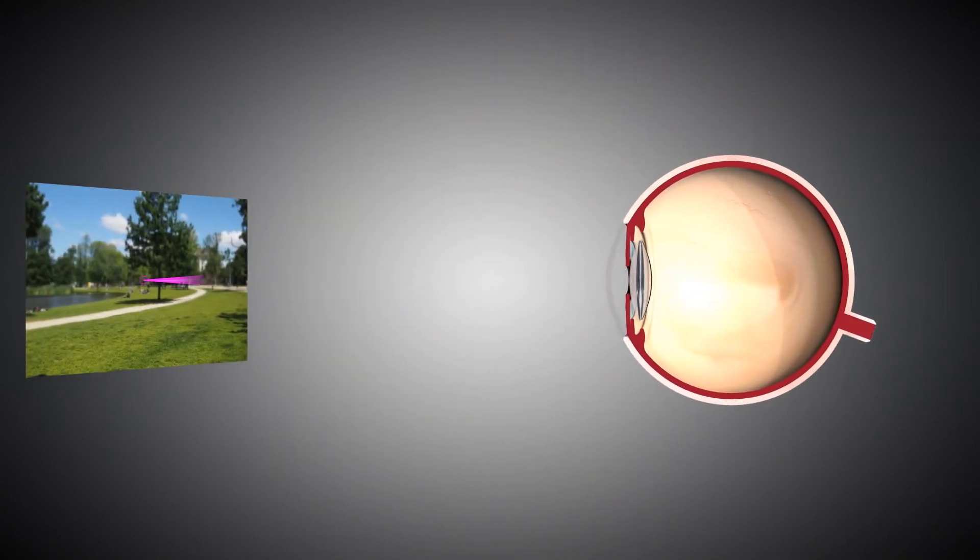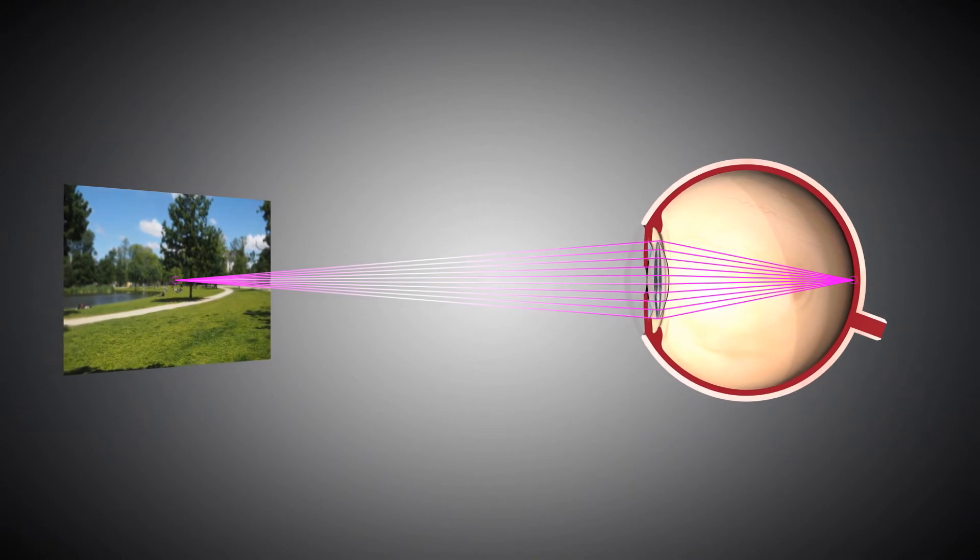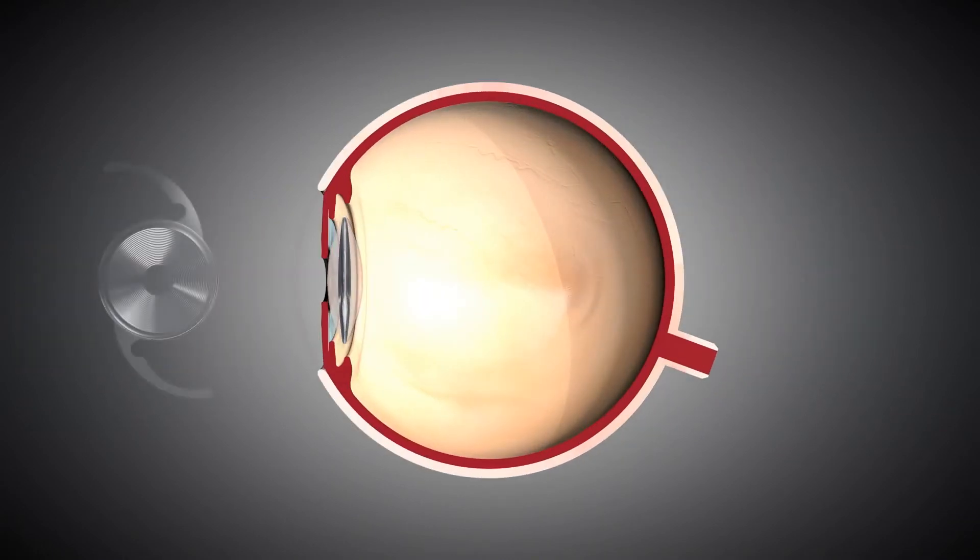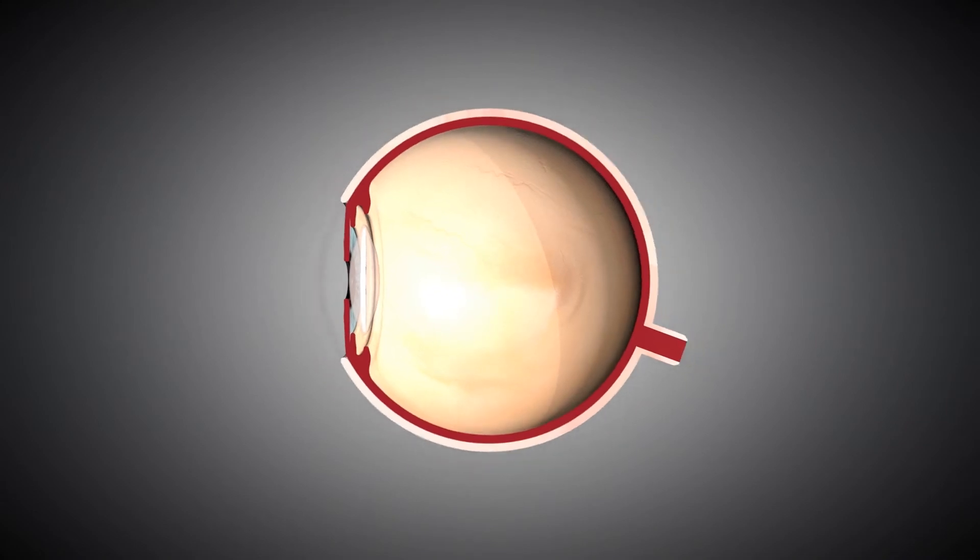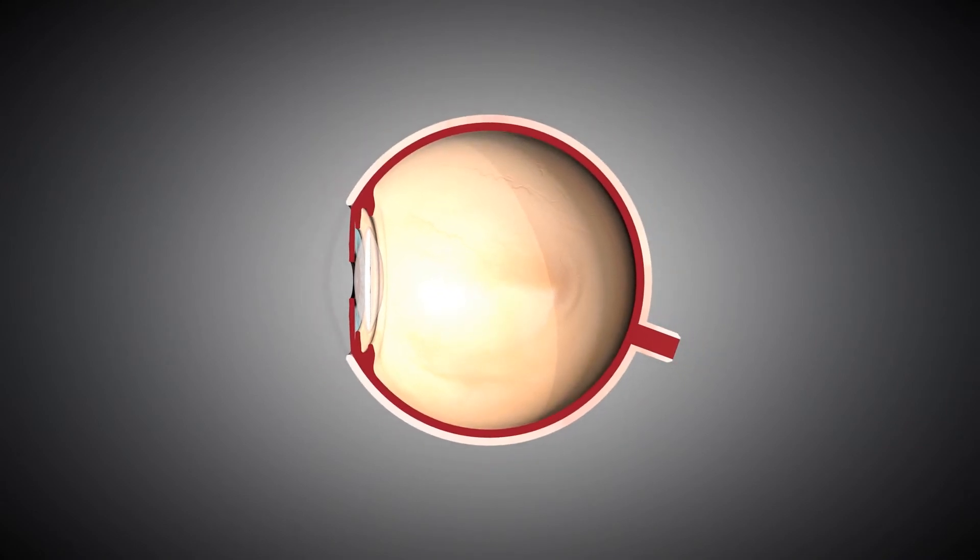Monofocal lenses enable patients to see clearly at distance. Patients may select a presbyopia-correcting multifocal lens in order to achieve near vision in addition to distance vision.